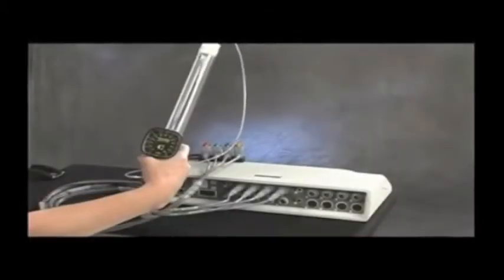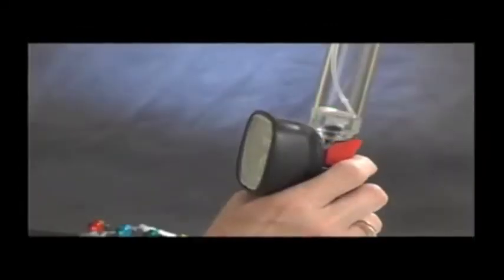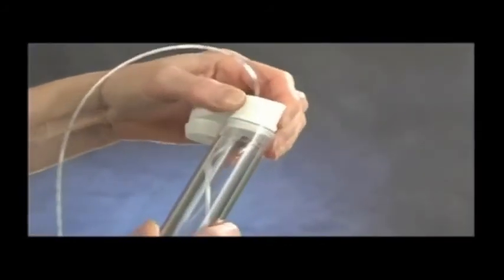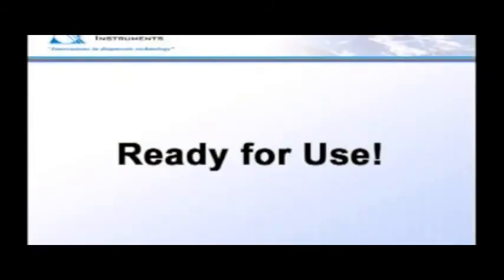At this point, squeeze the rubber bulb attached to the calibrator until it holds steady at the high level, 100 millimeters of mercury. Then, click on the check mark icon located in the bottom left of the screen. When the message "Calibration Succeeded" appears on the screen, click on the yellow Save icon in the lower left-hand corner of the screen. Then, you may release the pressure from the calibration unit by holding the red trigger lever down. The silicone cap and catheter can be removed from the calibration tube. The catheter and the system are ready for use.